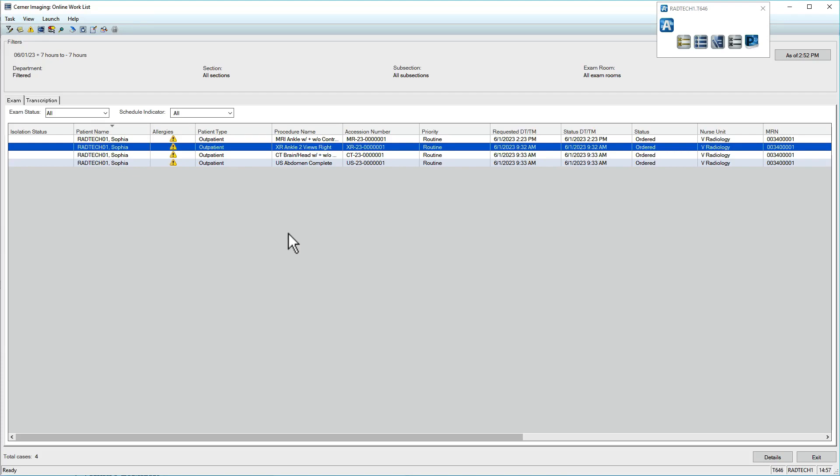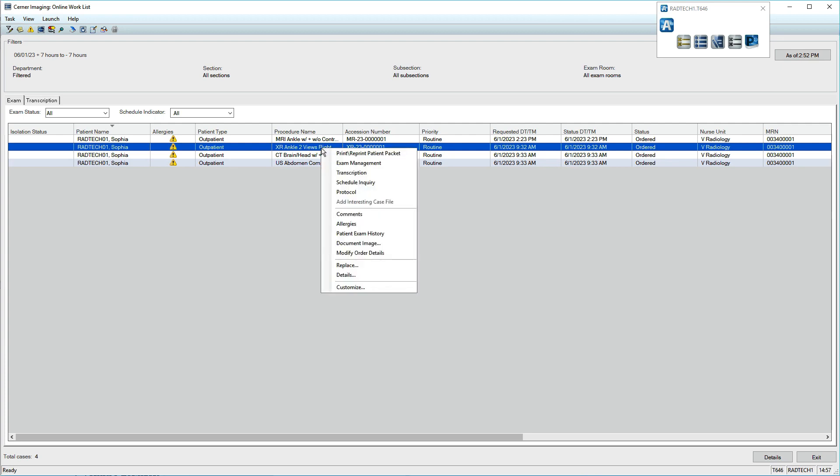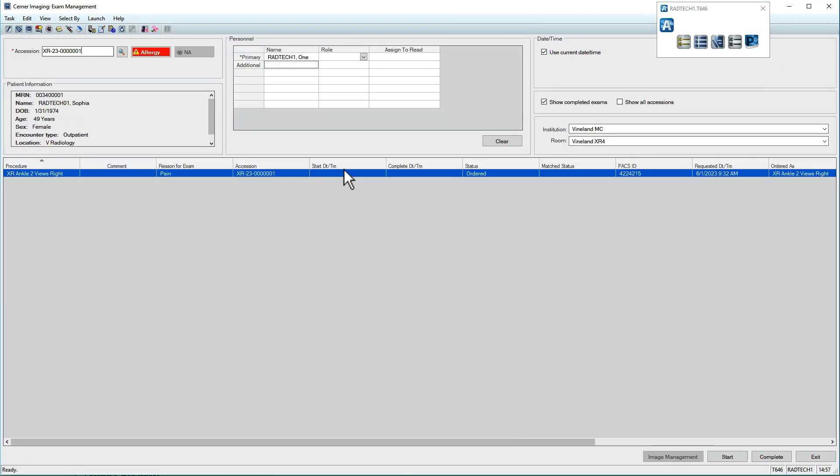The most convenient way to open exam management is via the online work list. Right-click an order and select Exam Management. The application then opens to the appropriate exam.